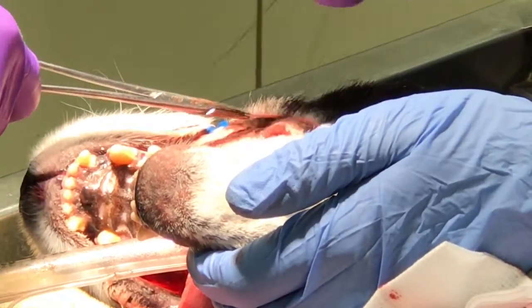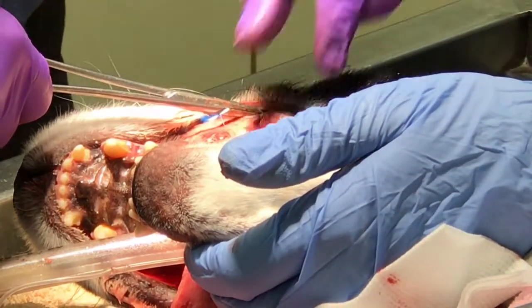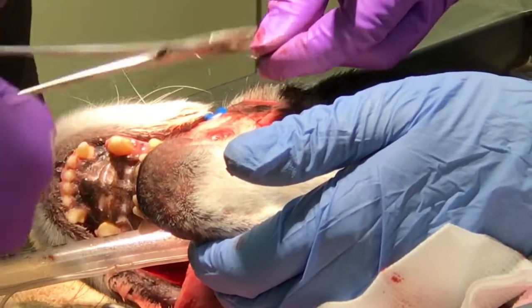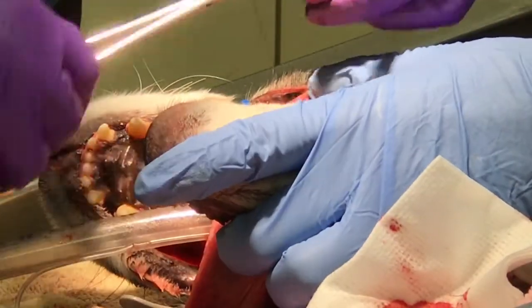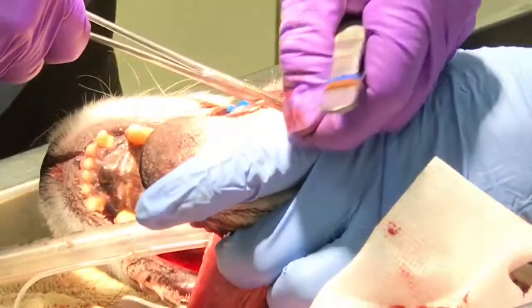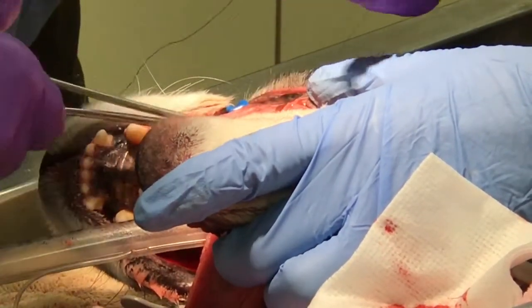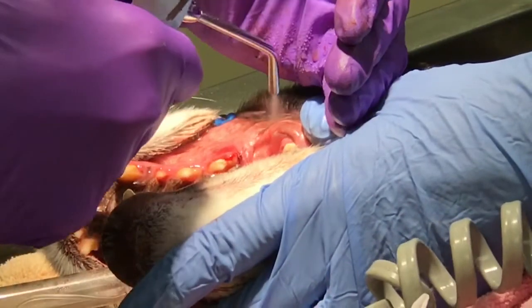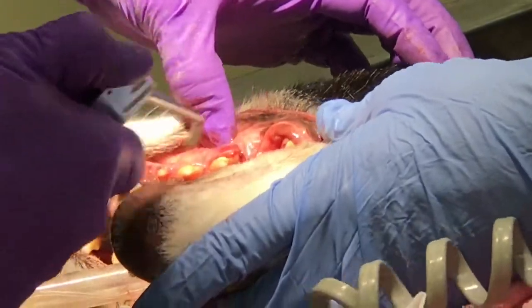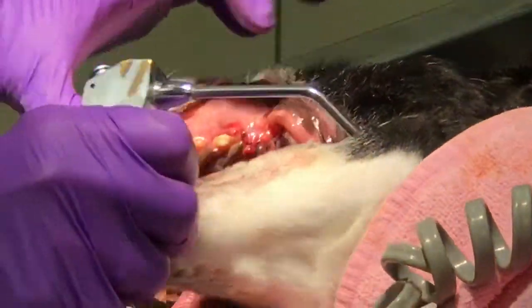Following the extraction, we'll take a post-extraction x-ray just to confirm that everything was truly removed. You never want to leave any kind of a root tip or fragment behind, as those have the potential to create pain and they can also abscess. We've pretty much got our extraction performed, and we are one tooth shy.